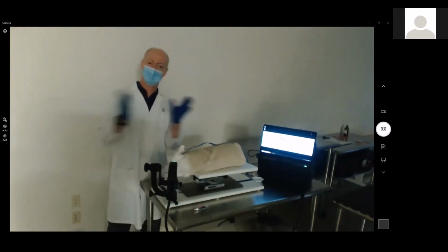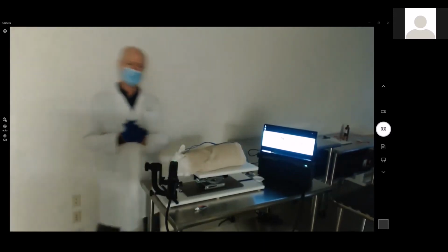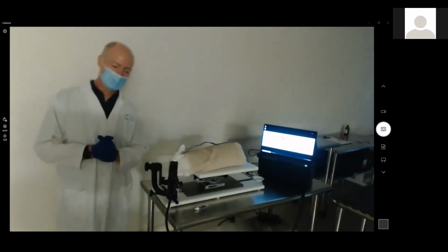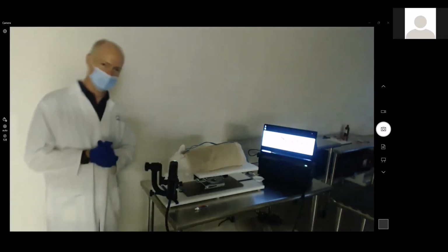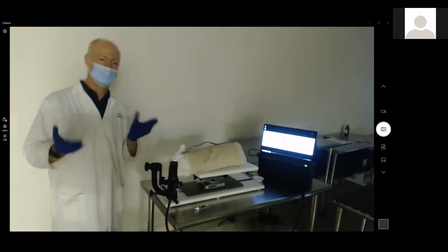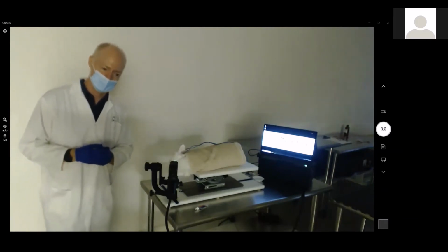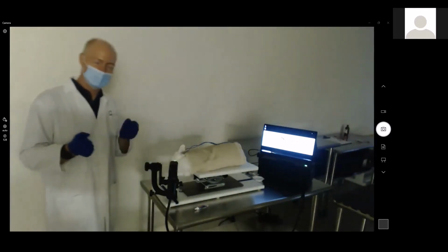Most people are very familiar with trying to get imaging using ultrasound. It is very similar to trying to capture an ultrasound, except you're now working at a 5-micron axial resolution. Even one of the best UBMs can only do approximately 30 microns in resolution. So any type of motion, any type of movement is just an amazing change.